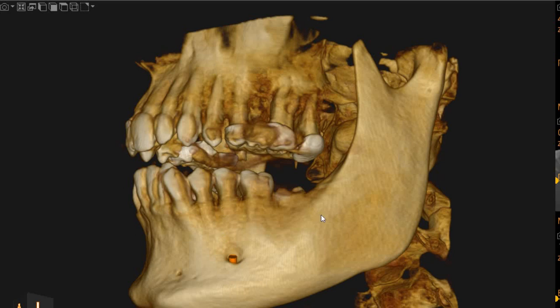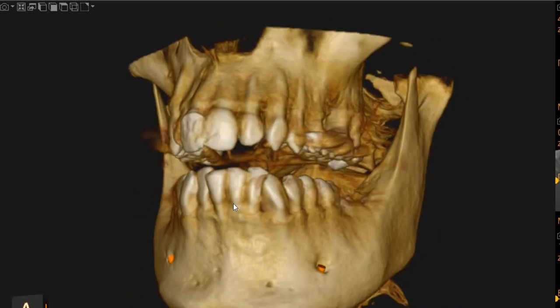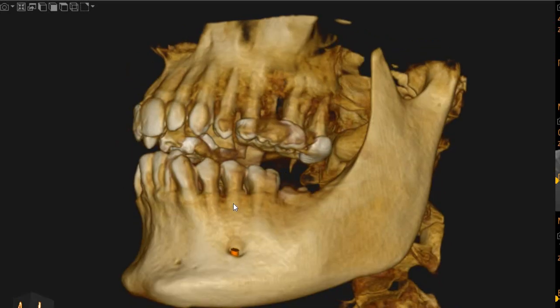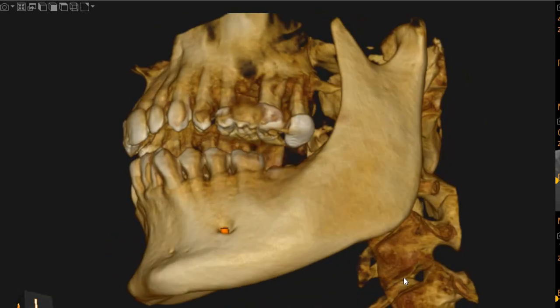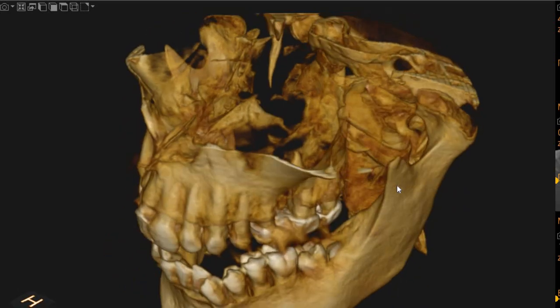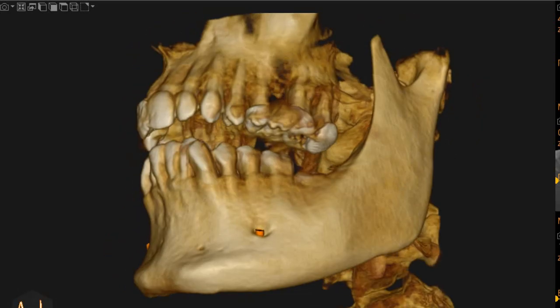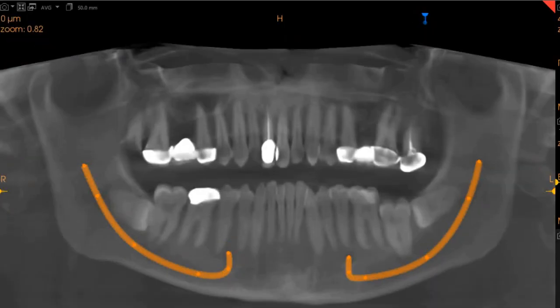As-salamu alaykum, Ultroscan Diagnostics. This is the CBCT of the patient that you have requested. The area of interest is the lower right wisdom tooth and its approximation to the inferior alveolar nerve.